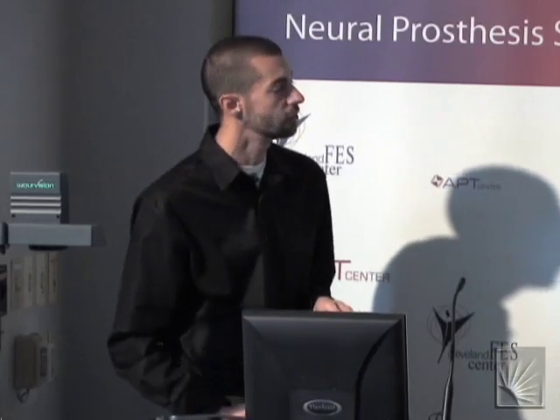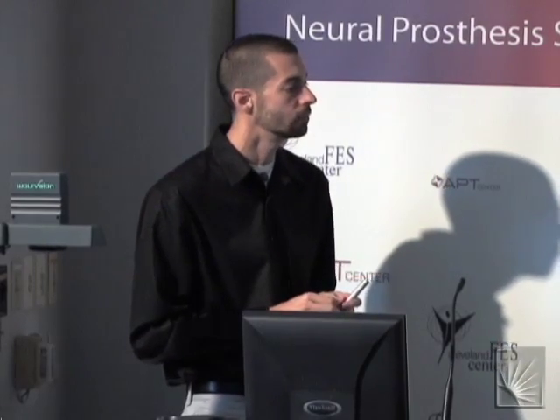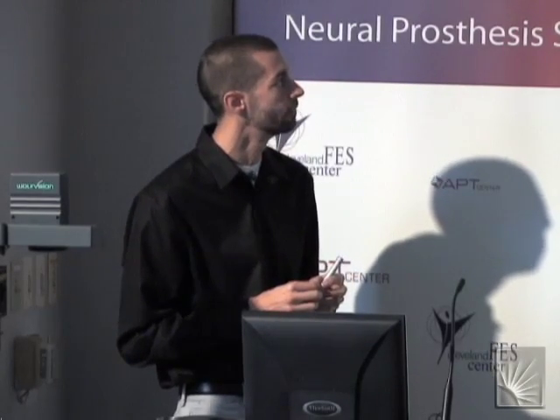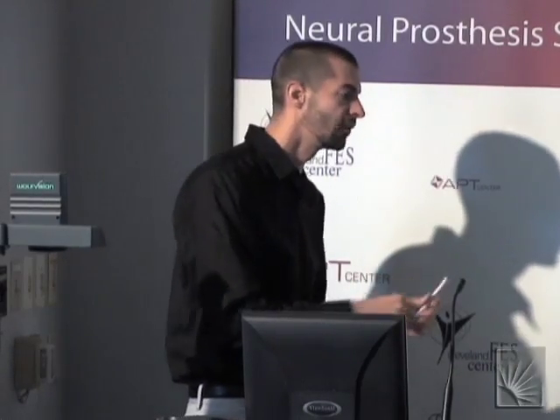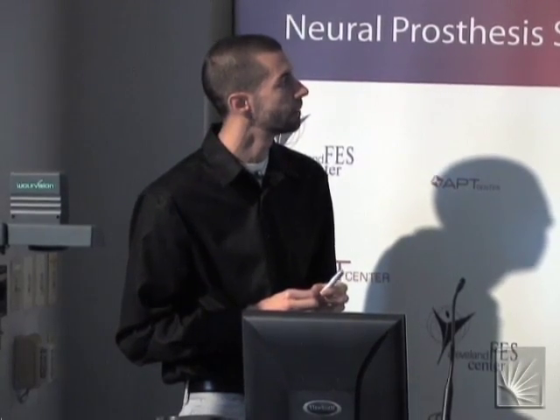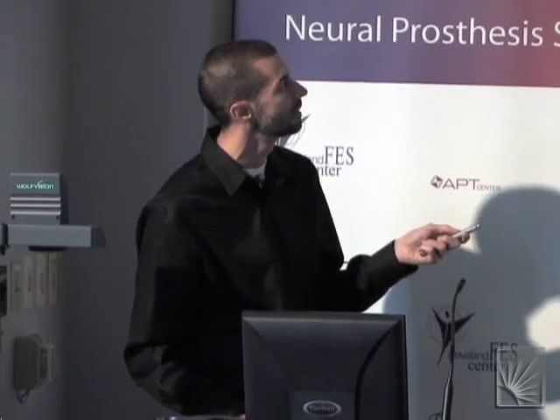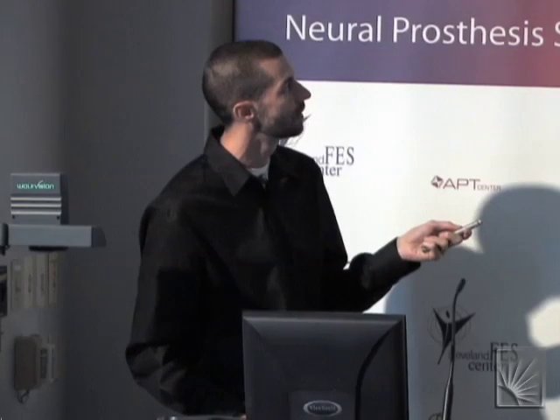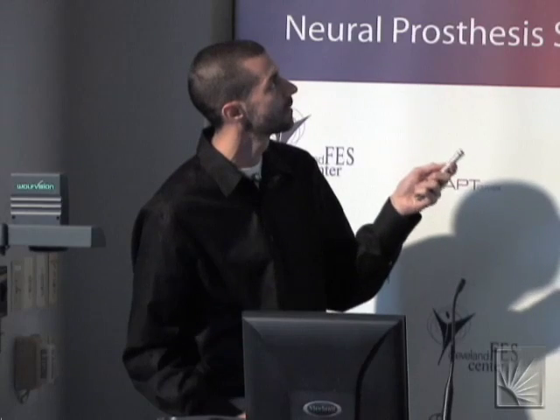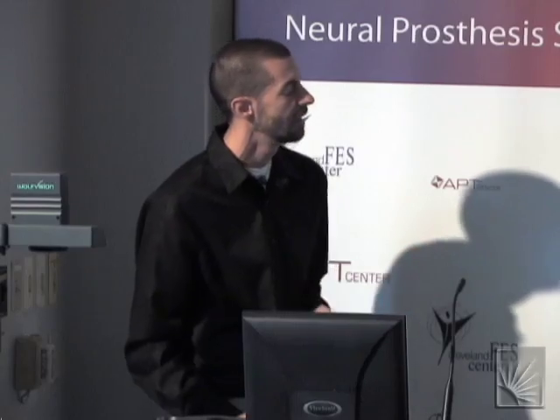The study was set up to evaluate, the idea was to develop a quantitative evaluation of something that's more than just their motor effect or more than just their cognitive effect. So the task was a dual task study where they were performing a force manipulation with their finger and thumb here, where they're trying to track or do a force tracking task in combination with a working memory task.